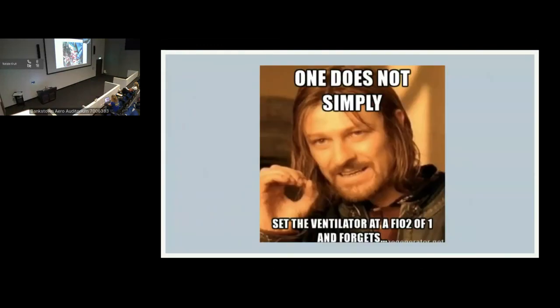Then I want you to turn your attention to the ventilator. This is normally done in conjunction with the ECMO doctor as well, but we transition to rest settings normally. So that's otherwise known as 10-10-10. So we have a rest rate of 10, a PEEP of 10, and a P inspired of 10.